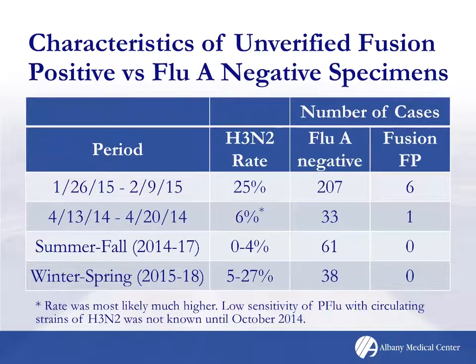Okay, so what about the additional samples that were positive by fusion only? In the additional samples that we tested, there was one more that was positive for Flu A that was not positive by any other assay. But the only positive samples by fusion that were negative by all the other assays were samples that appeared during periods of high influenza prevalence. And in the samples from the summertime, there was never a false positive, or even in other seasons, especially during H1N1 seasons.